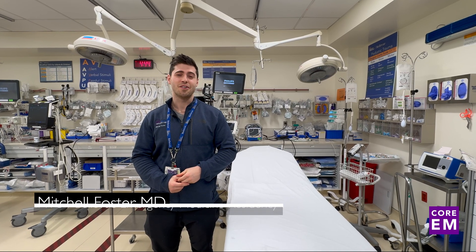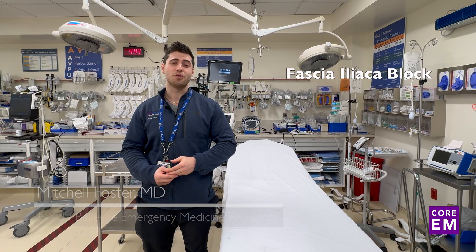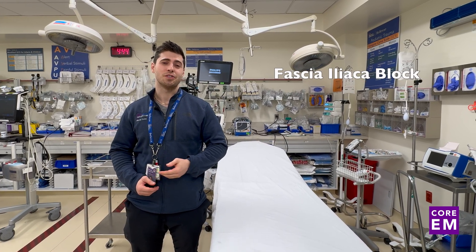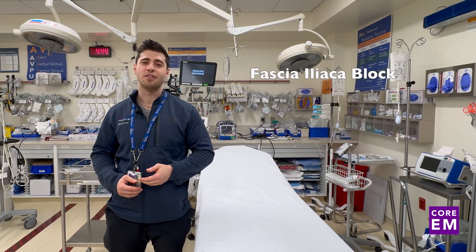Hi, my name is Mitchell Foster. I'm a resident here at NYU. Today we're going to be talking about the fascia iliaca block. This is a very useful block for providing analgesia with your patients with proximal femur fractures and other hip fractures while awaiting definitive intervention.